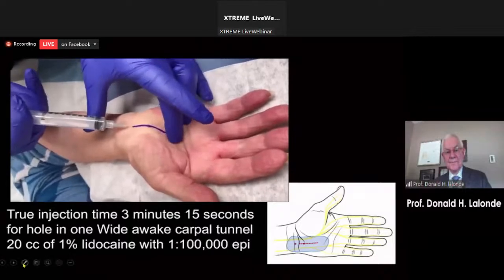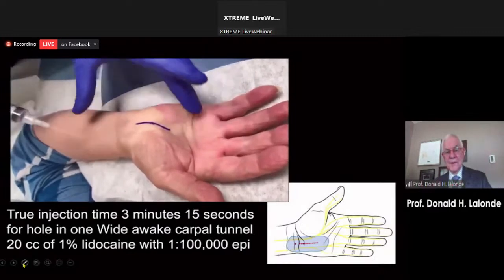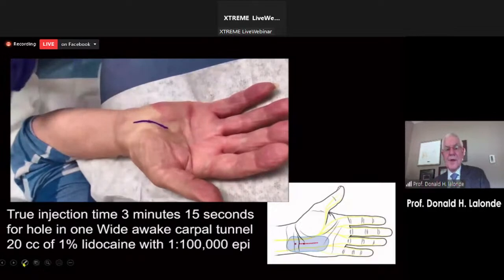So you felt the first little sting of the poke. And have you felt any pain at all since then? No. Okay, well, we're all done the freezing. That's it. Good. So if you inject local anesthesia properly, they only feel one little poke at the beginning. And that's a 27-gauge needle I'm using. It's very small. All of you can go find the person in your hospital who orders the needles and ask to see their screen so that you can see the needles that they can buy, and they can buy smaller needles. You don't need giant needles. So I mostly use 27-gauge needles.